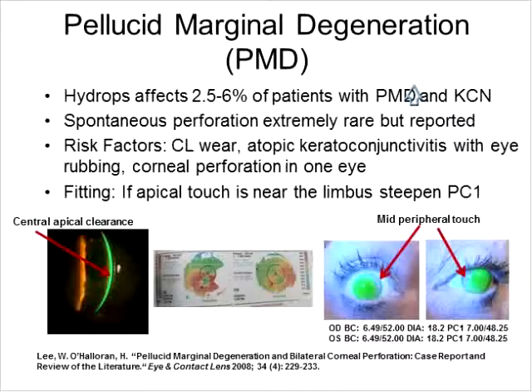I've had one case of a patient who had corneal cross-linking and intacts, and I'm currently in the process of fitting him now. We had to halt the process because he developed a corneal melt right along the intact area and had to have that intact removed. So I'm just starting to refit him again. I haven't had any long-term experience with corneal cross-linking at this time.